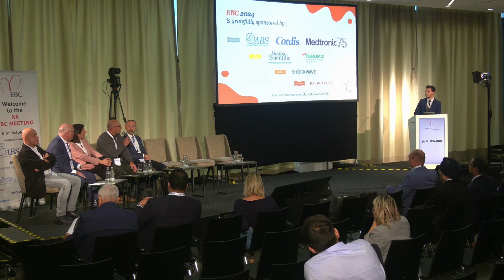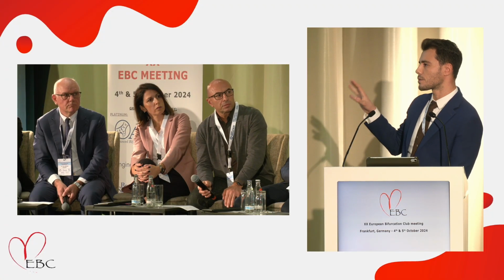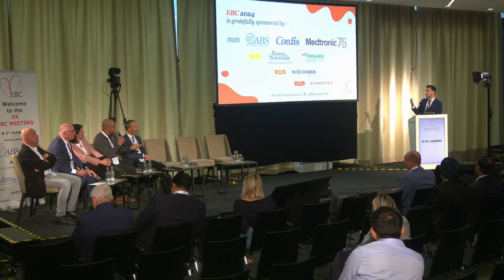Thank you very much for the presentation. Do you use imaging during the study in each case to confirm the distal strut passage, or just for malapposition? No. It's mandatory at the end of the procedure in this study. Okay. But just to fix distal malapposition or distal deformation of the result. To decide to do kissing or not. Yeah, then if the result is not satisfactory the operator can decide to cross over to the other arm.